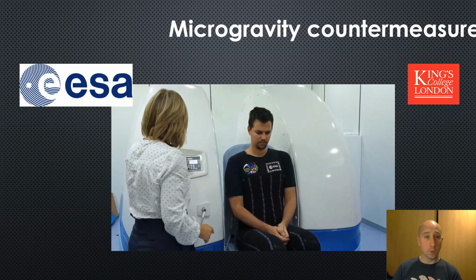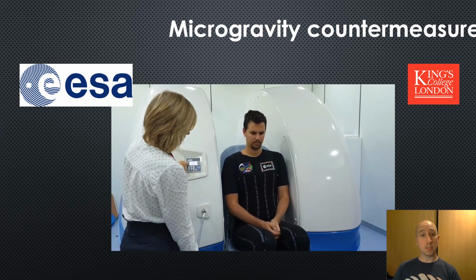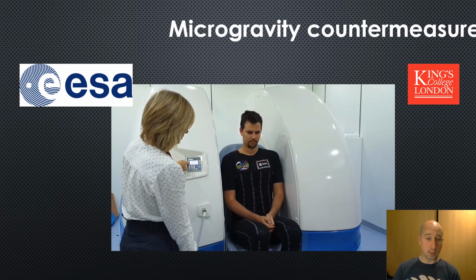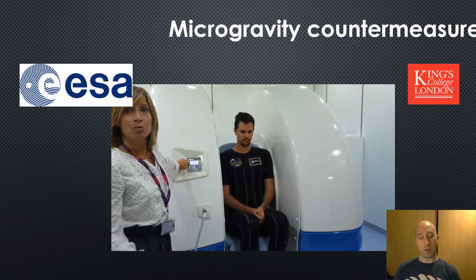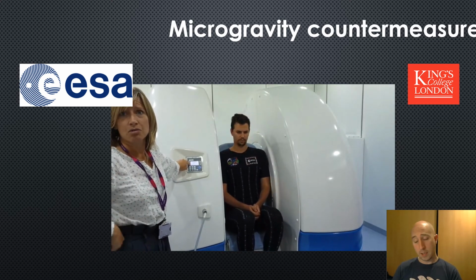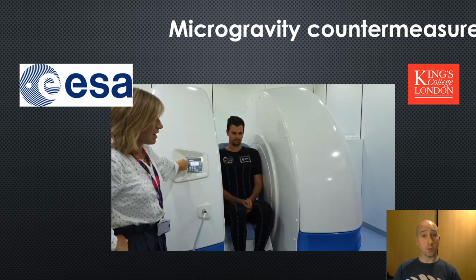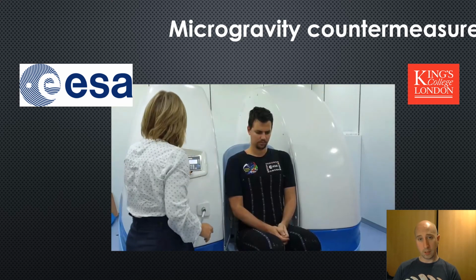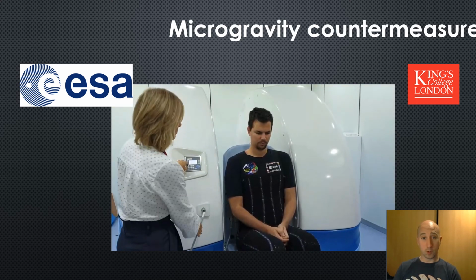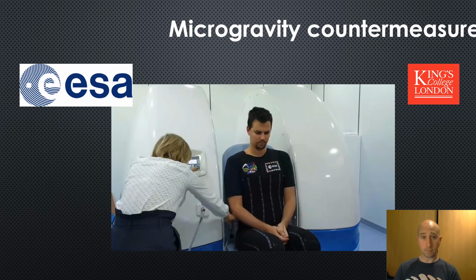We've even worked with the European Space Agency to investigate how the effects of microgravity during spaceflight might be counteracted, if the unloading of the spine affects the mechanics of the spine. Here we're seeing a participant going into an open upright MRI, but the same participants also underwent fluoroscopy too. That paper is currently in preparation.